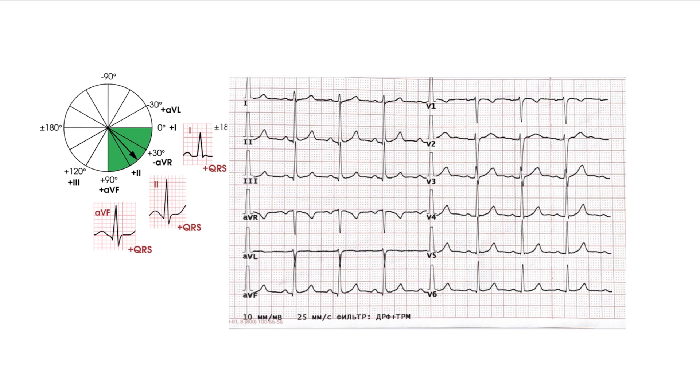Some ECG for training. On this ECG we can see a positive QRS complex at all three leads, it's normal axis.